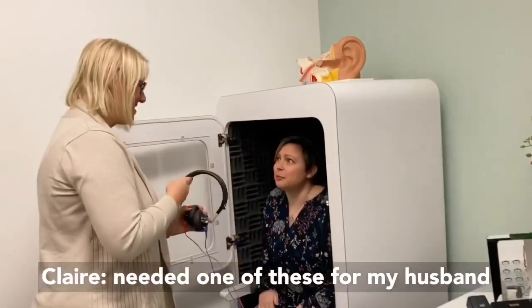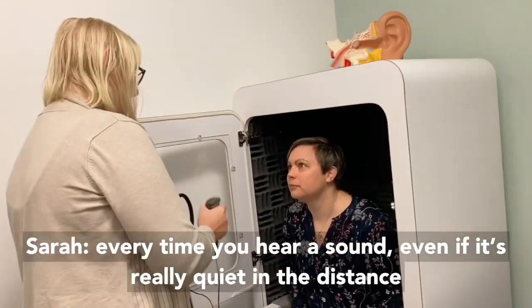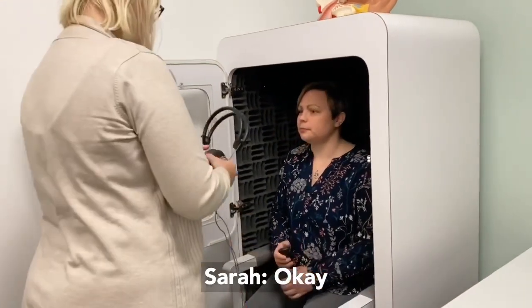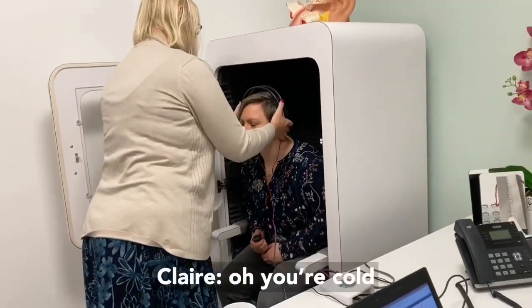I needed one of these for my husband. Put him in it. Yeah. Every time you hear a sound, even if it's really quiet and in the distance, press the button for me. Okay. So here's the button. Yeah, okay. Like my hair. Oh, it's cold.